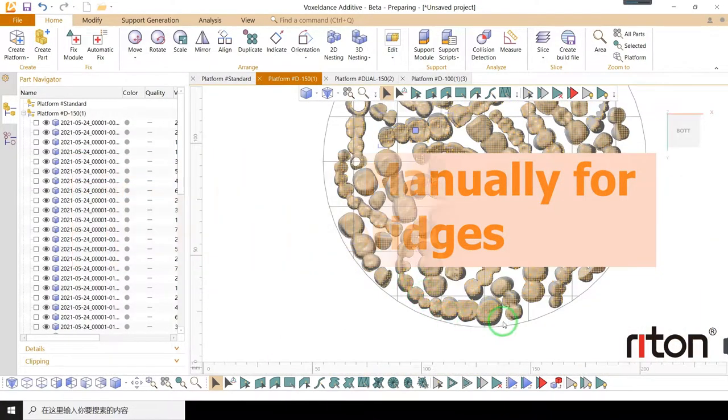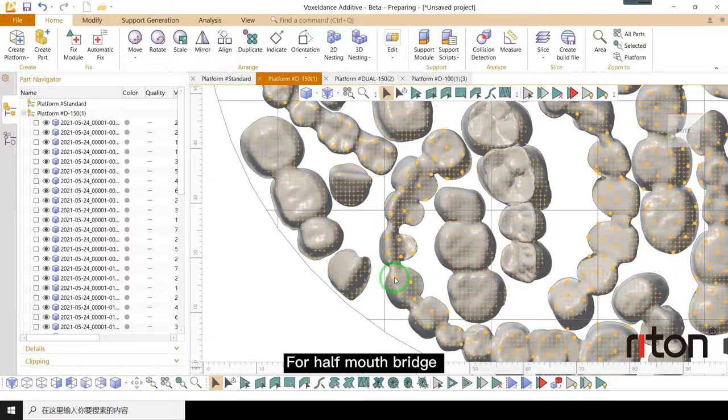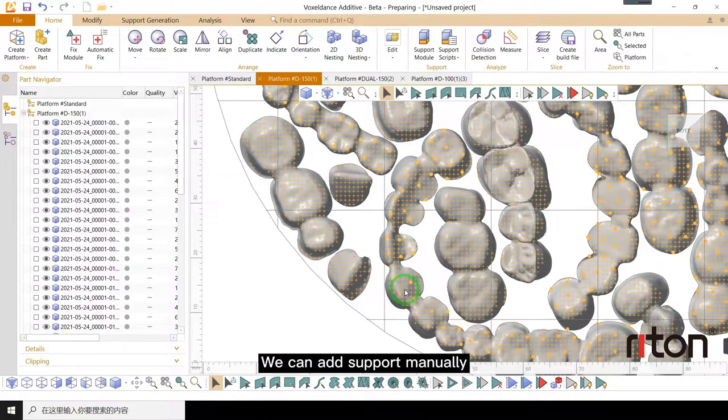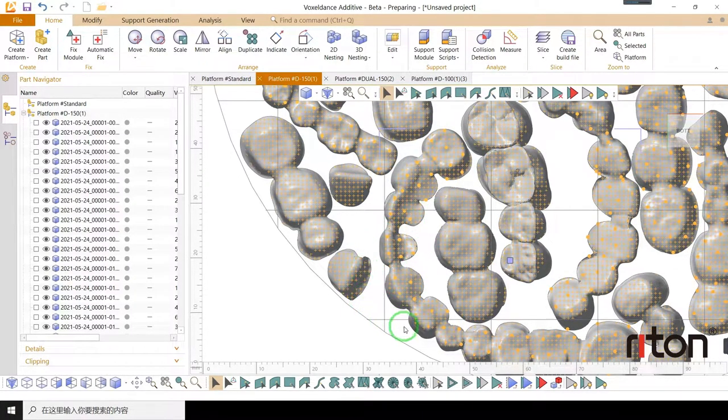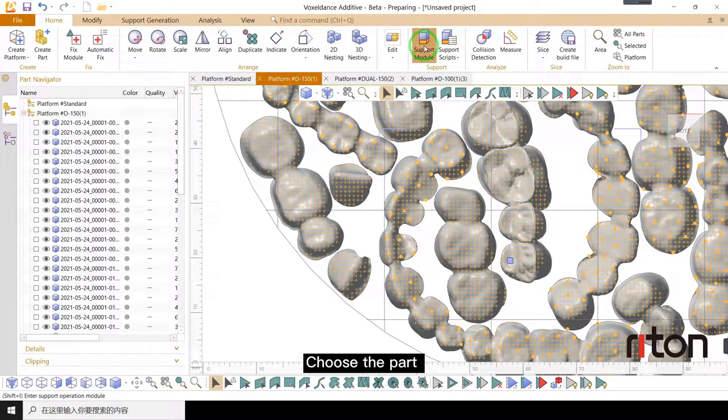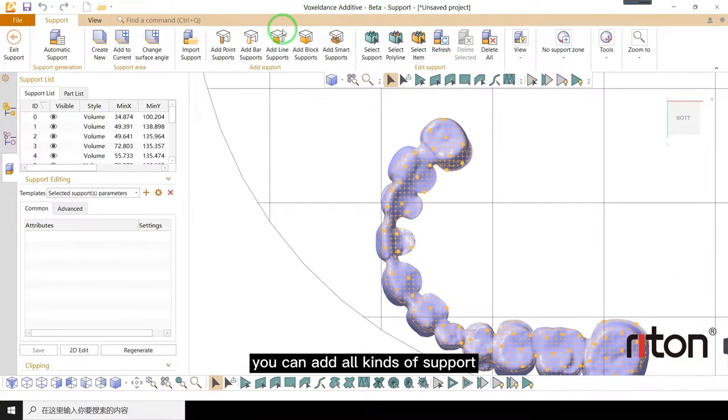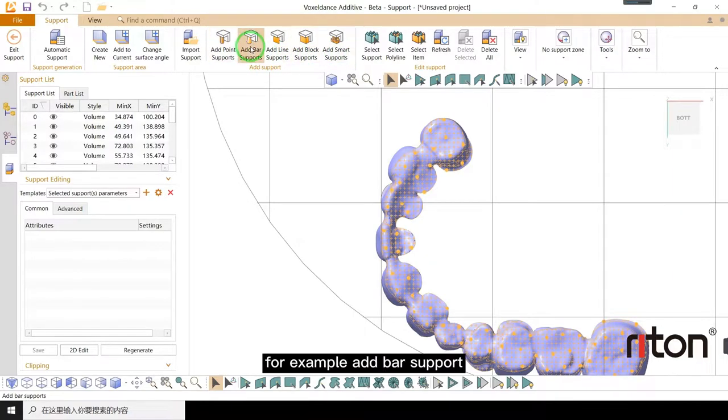For half mouth bridge, we can add support manually. Choose the part, enter support module. You can add all kinds of support. For example, add bar support.